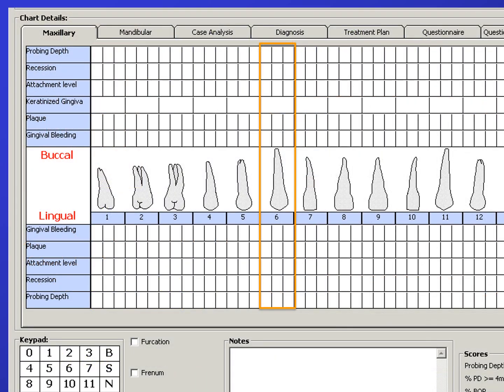There is a tab for the maxillary arch and a tab for the mandibular arch, because each tooth has multiple columns and rows of information. The information for the maxillary right canine, number 6, is recorded within the area outlined with the orange rectangle. At the top of the charting we see 2, 5, 3. The 2 means a 2 mm probing depth at the distofacial of number 6; the 5 indicates a 5 mm pocket at the straight facial; and the 3 is a 3 mm probing depth at the mesiofacial.